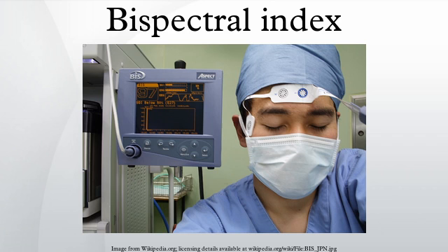Bispectral index is one of several technologies used to monitor depth of anesthesia. BIS monitors are intended to replace or supplement Guedel's classification system for determining depth of anesthesia. Titrating anesthetic agents to a specific bispectral index during general anesthesia in adults allows the anesthetist to adjust the amount of anesthetic agent to the needs of the patient, possibly resulting in a more rapid emergence from anesthesia. Use of the BIS monitor could reduce the incidence of intraoperative awareness during anesthesia.